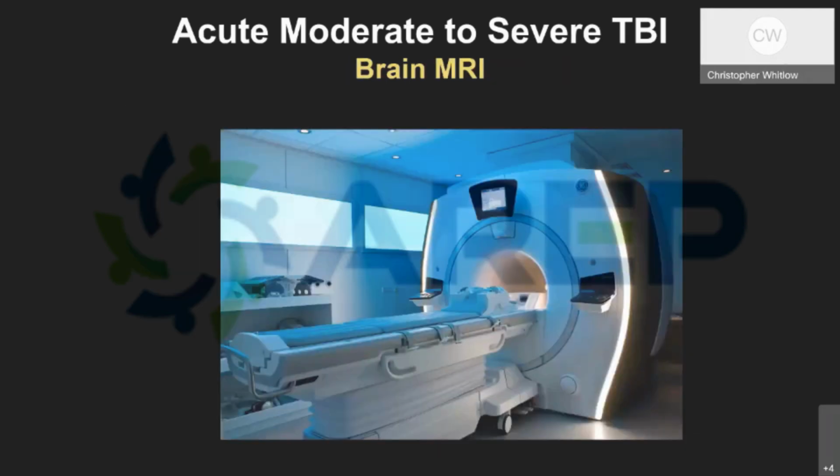Now, MRI, magnetic resonance imaging, is not currently indicated as a primary diagnostic imaging modality for acute TBI, and part of this is because of the complexity of scanning these patients emergently. That being said, I think we'll all agree that it's common practice to acquire, in a lot of cases, a brain MRI when the results of a non-contrast head CT are normal and there are persistent unexplained neurologic findings after a TBI, and this is a class 1 recommendation.